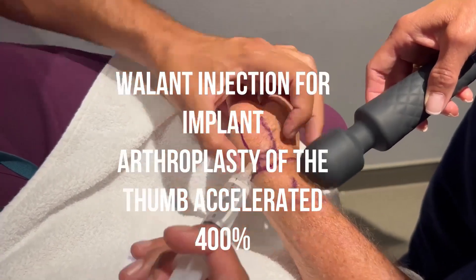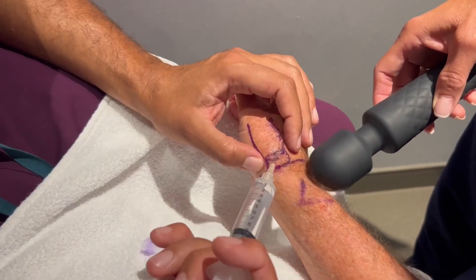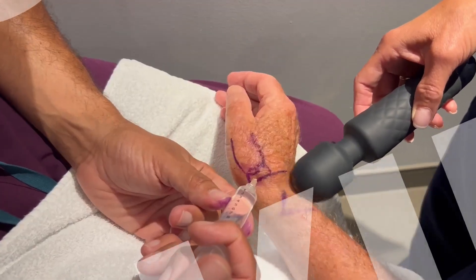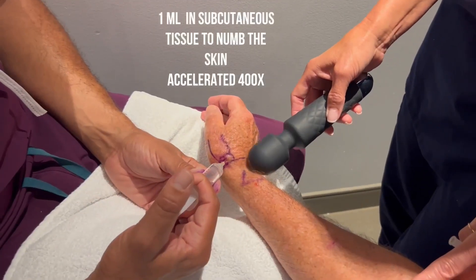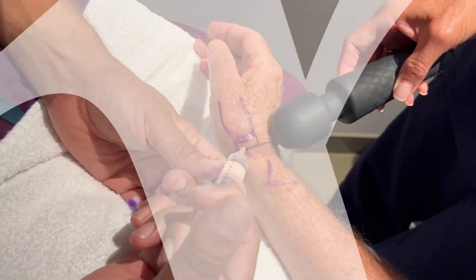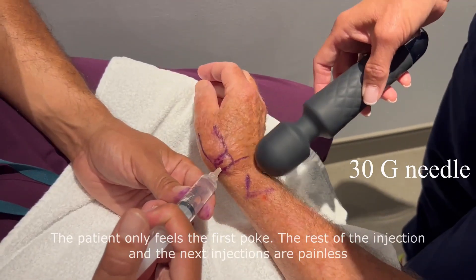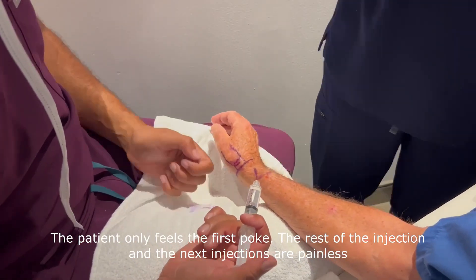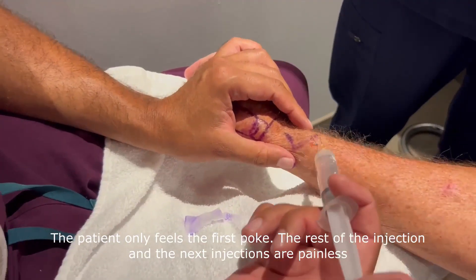As you can see, we have drawn the outlines of the first metacarpal bone, the trapezium, and the wrist crease. We're starting to inject using a 30-gauge needle, about one cc in the subcutaneous tissue of the dorsal aspect of the trapezium.